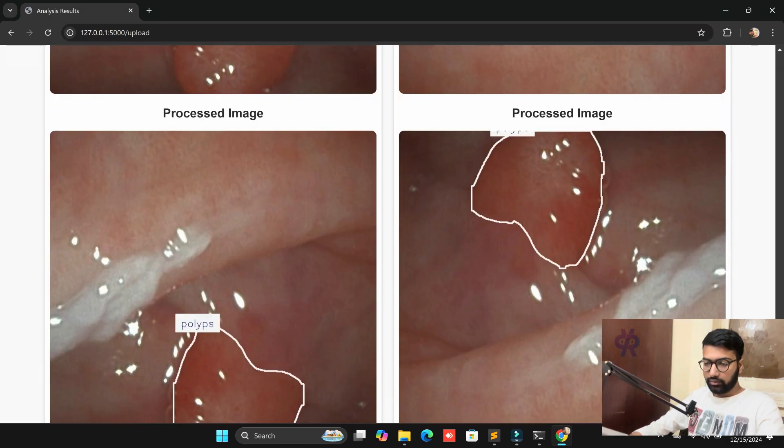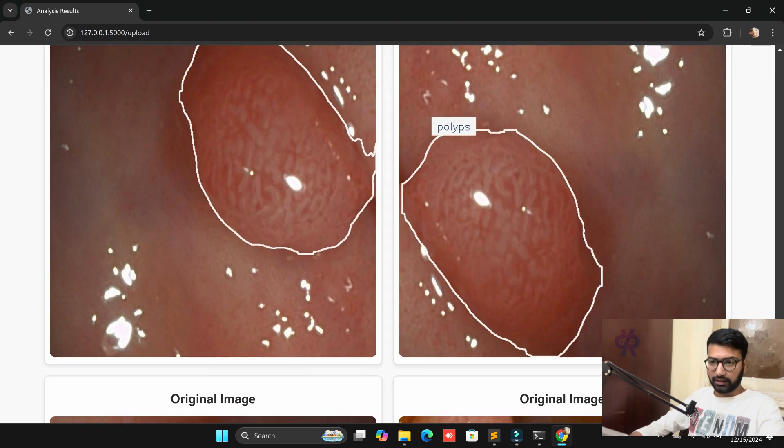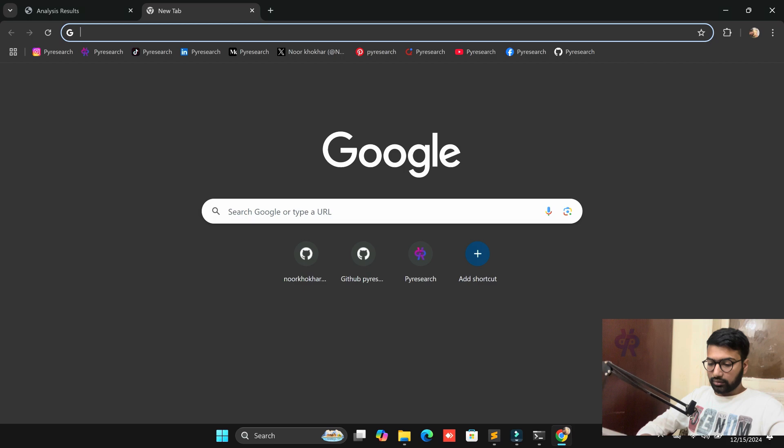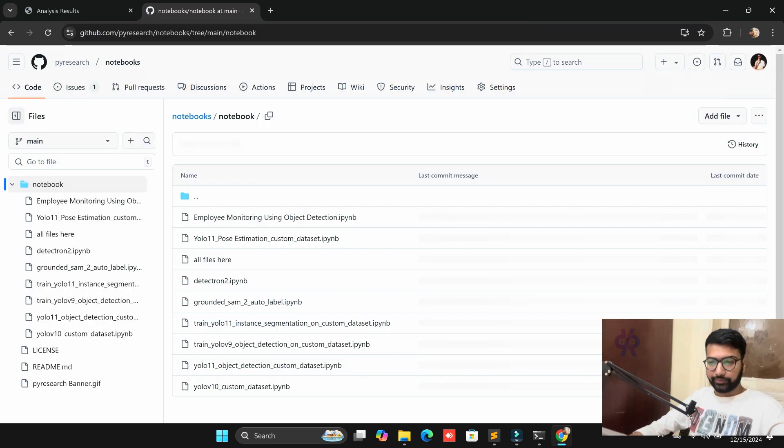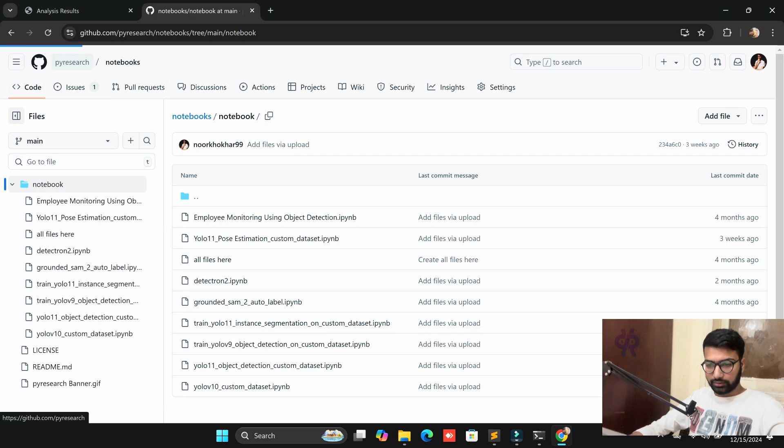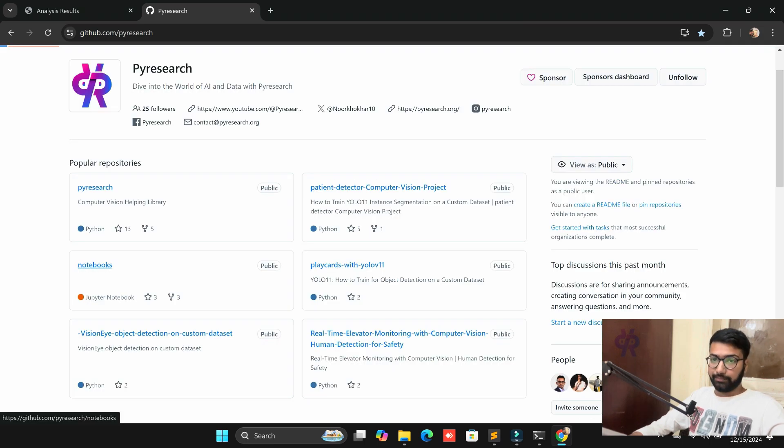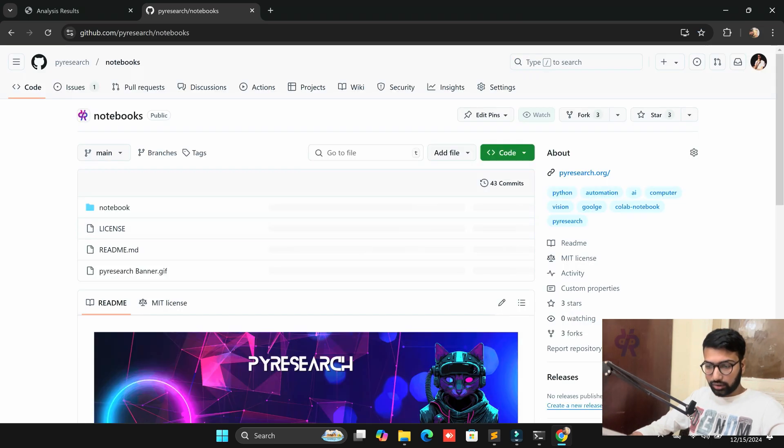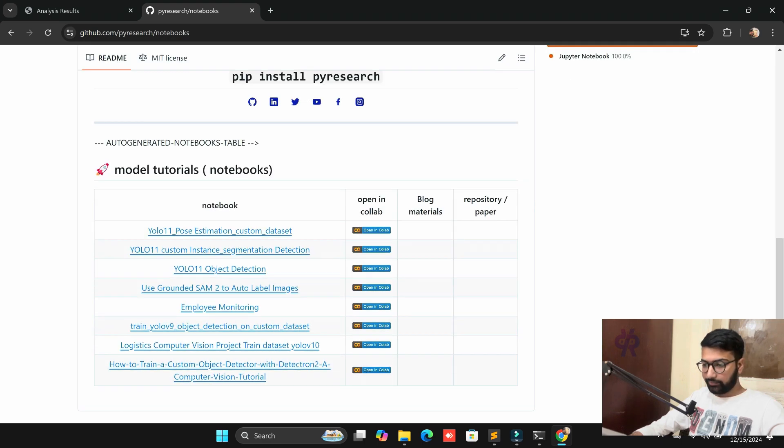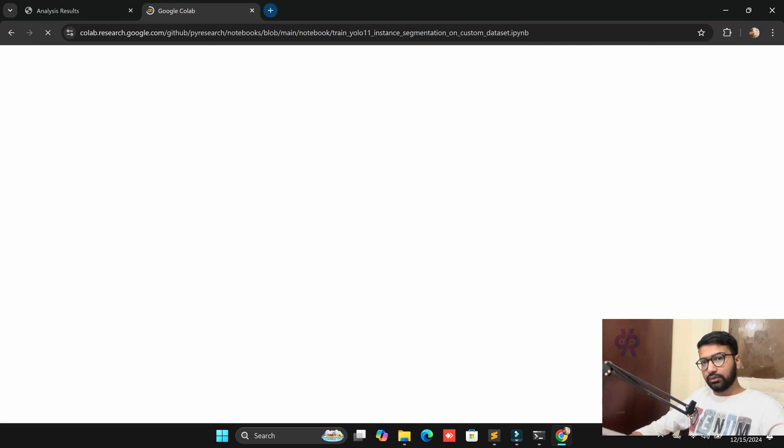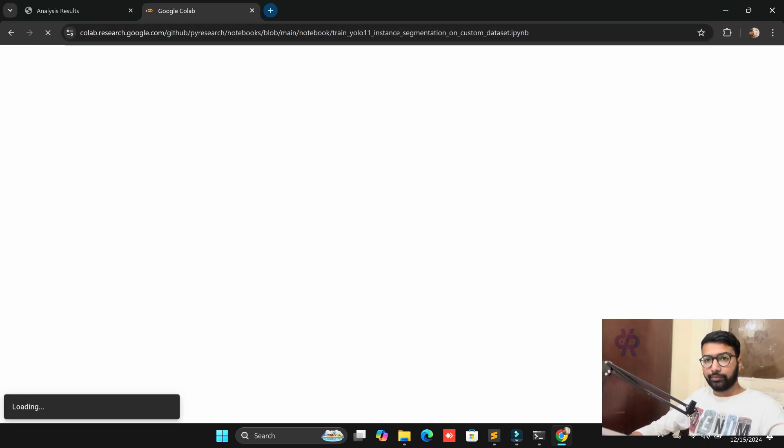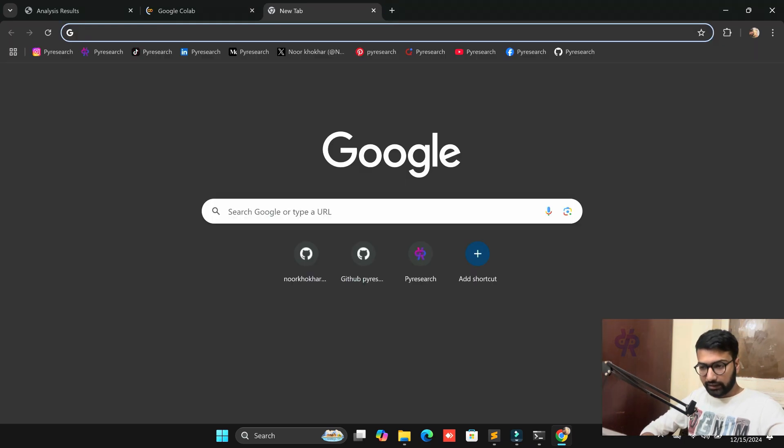We start from scratch. The demo is successfully done. Now in technical point of view, you go to the Roboflow notebook side, PI Research notebooks from here. We need segmentation, so YOLO 11 custom dataset image segmentation.